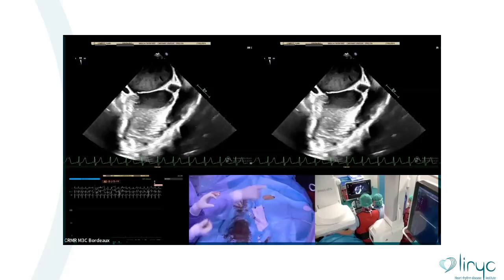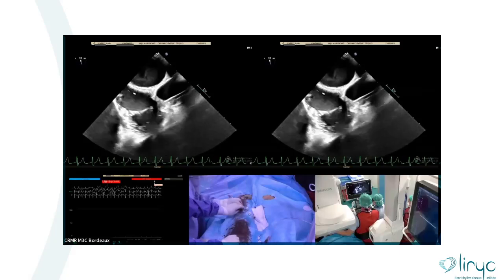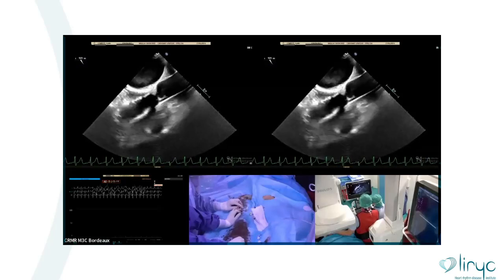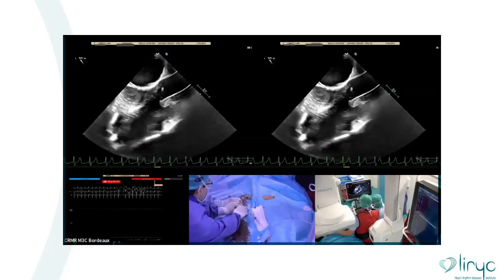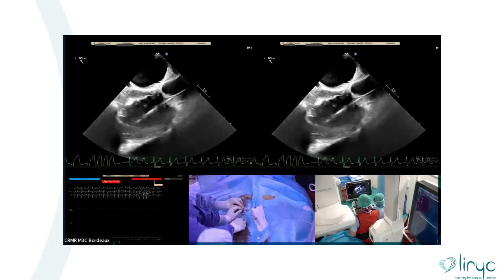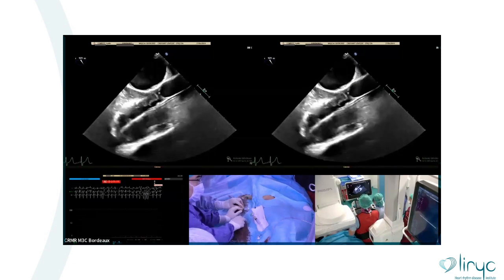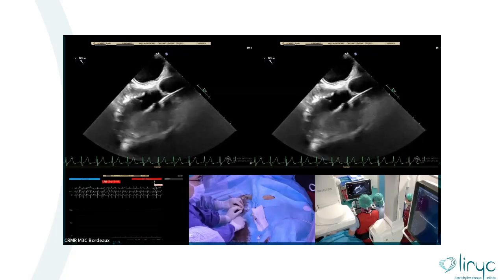But if you pull the wire out, the bubbles will go away on the apex. So don't worry, we can do the test. I teach you that. Echo, can you show me the wire or the shadow on the right ventricle? Yeah, good. And we pull the wire out. I like to do the double test. We pull and we can find if the wire shadow disappears. No freeze, real time, and if you cannot find anything, it means that you haven't passed.